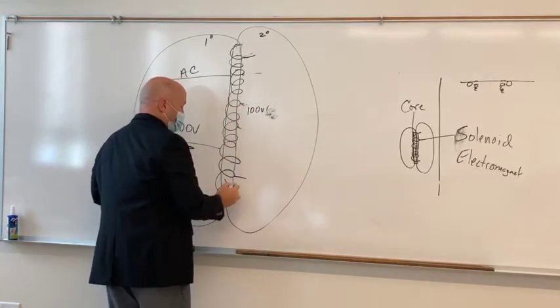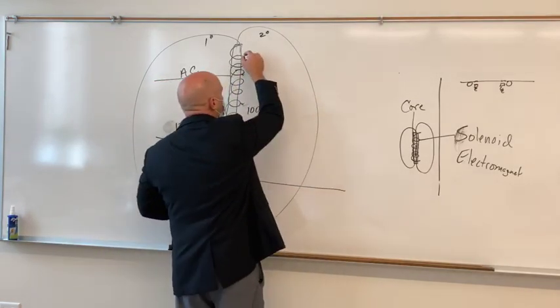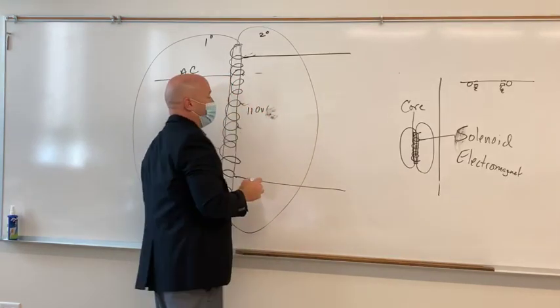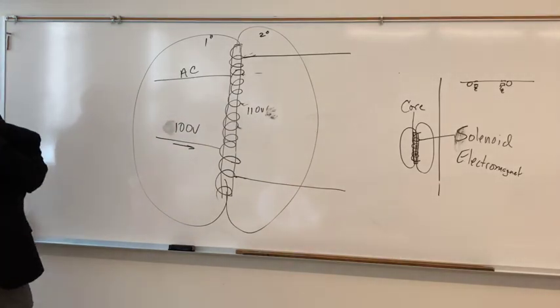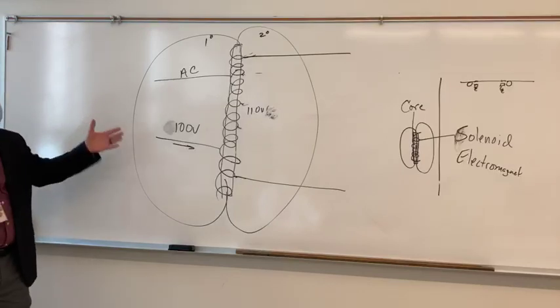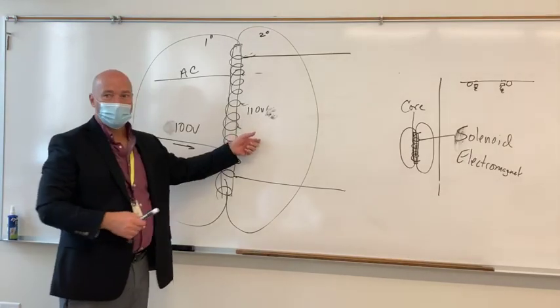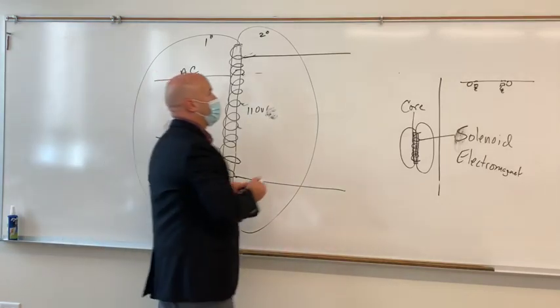So after it comes out of that, what does it go into? Let's say I've got 110 volts now. What does it go into after it comes out of the auto transformer? The auto transformer is a rheostat, it turns up, turns down, the magnitude of the voltage on the secondary side, based on the turns ratio. Where does it go after this? High voltage transformer, exactly.